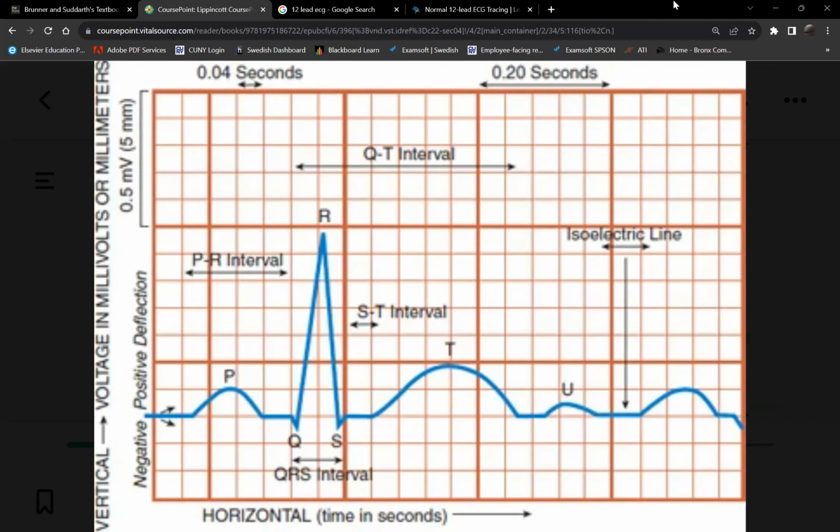So what happens, this appears when, let's say, this is your heart and someone has a heart attack. It's an ST elevation MI, meaning like this, ST elevation. That indicates the entire thickness of the patient's heart muscle died. So the blood clot that caused the heart attack caused actual death of the heart muscle. An entire thickness died. Because of this, the ST segment would appear like this.